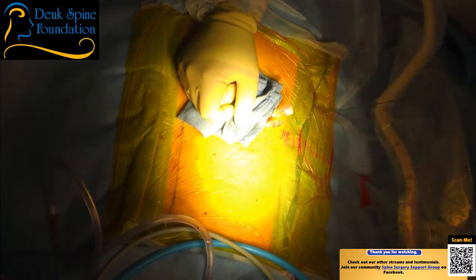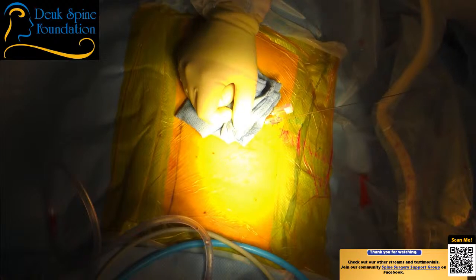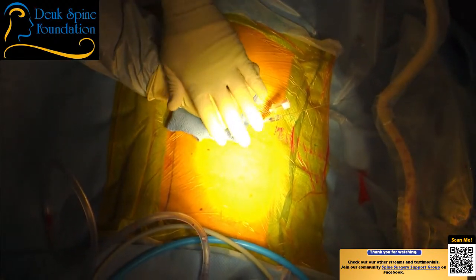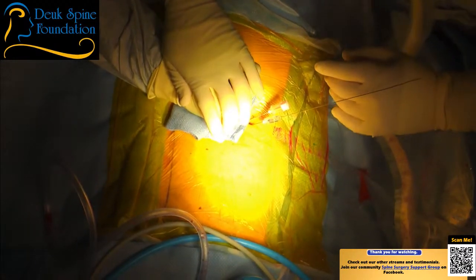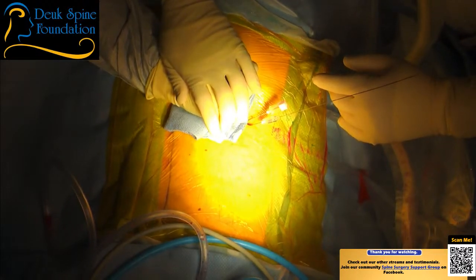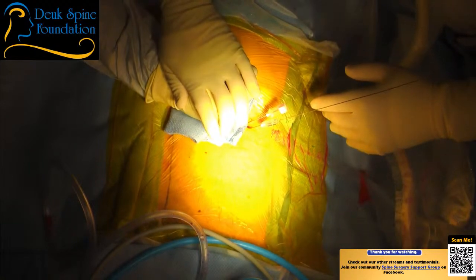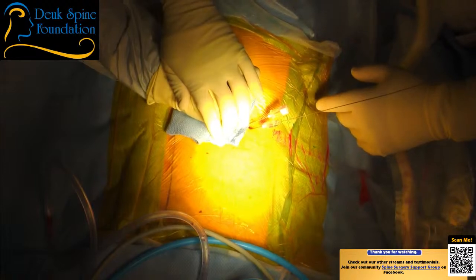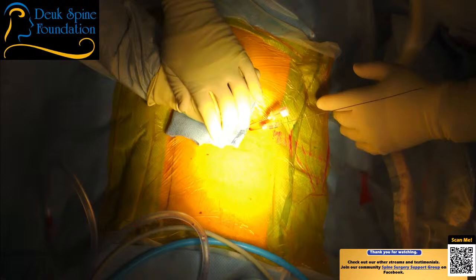But normally people who watch these surgeries, they could see that we do shave down bone spurs that are right near the nerve. And this laser can cut through steel. So if you're wondering, does it cut through bone spurs? There's very little this laser won't cut through. And we only have it at 20 watts, 30 watts. We have it at 30 watts. And I think it's a 100-watt laser, right? So we could crank it up if we want to. But even at 30 watts, it'll melt steel, stainless steel.